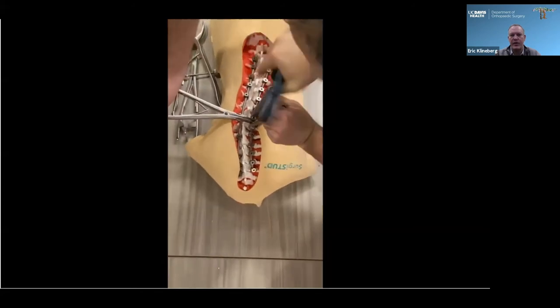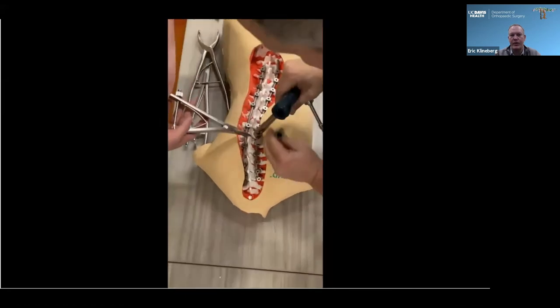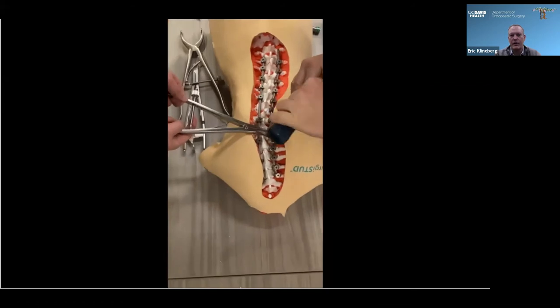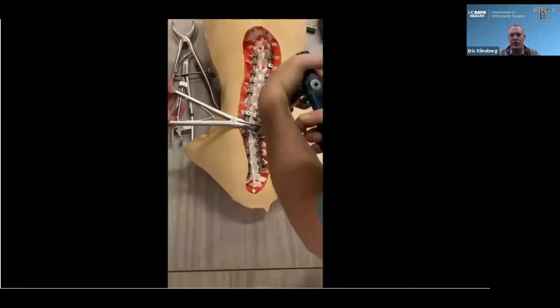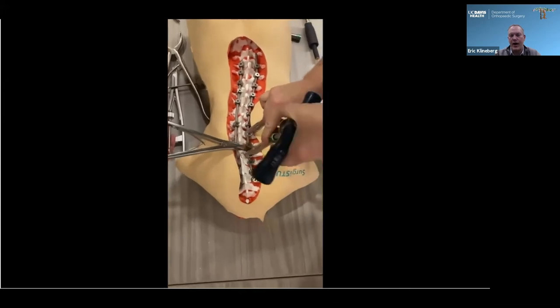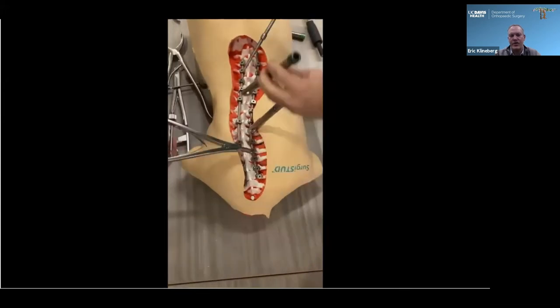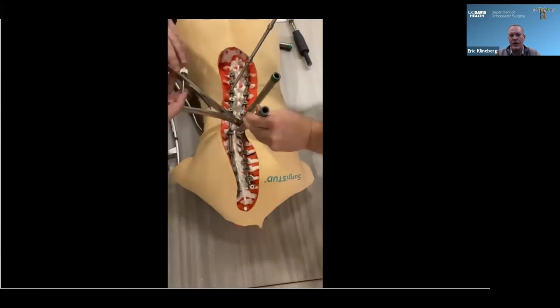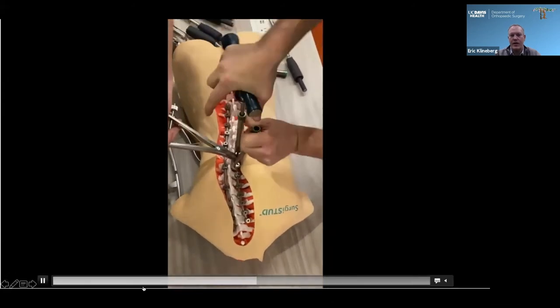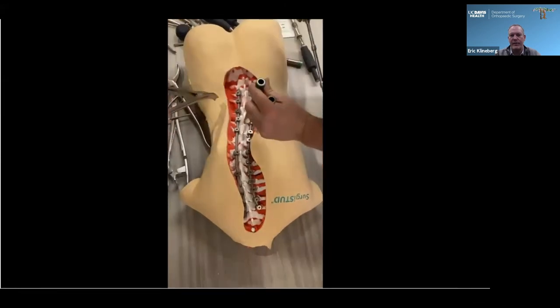And so there I am levering forward. You can see the tubes are in two different locations. Now we're going to work a little proximal, again really pushing one rod against the other. I usually don't go higher than around T6 or so, just because I think on that upper part of the thoracic spine, it's a little risky, and I don't think you get a big bang for the buck.